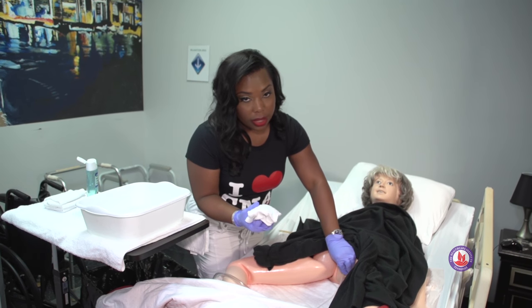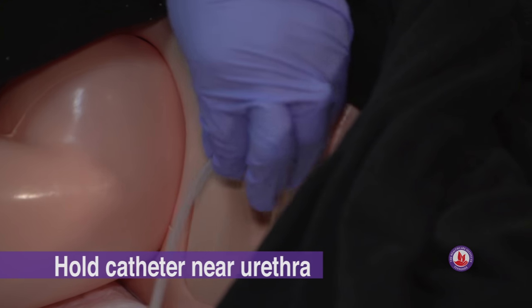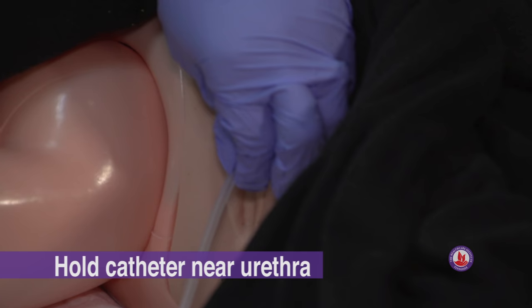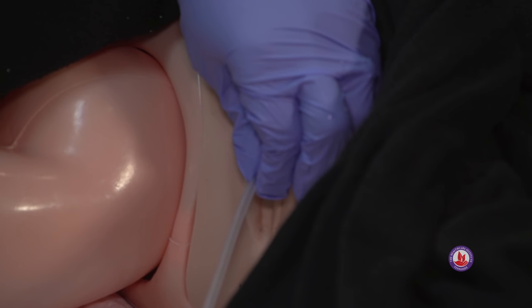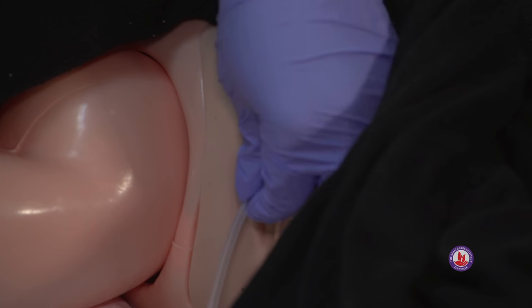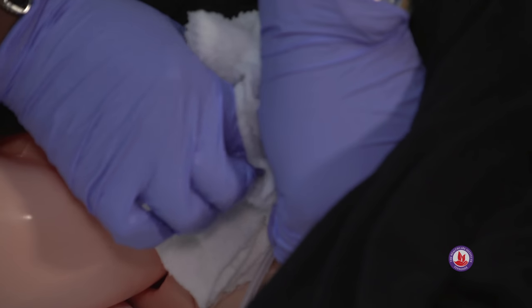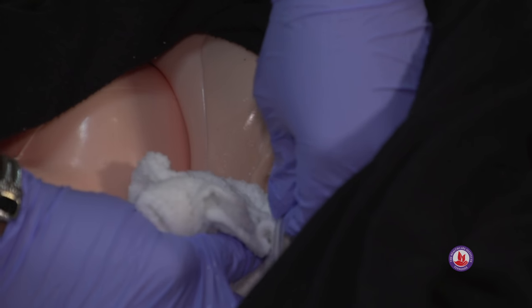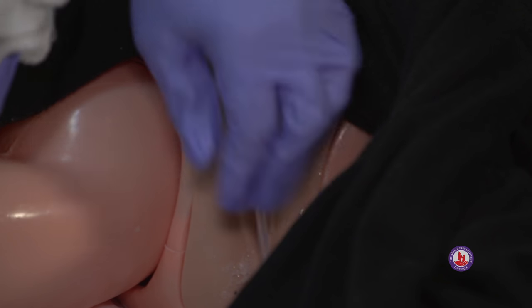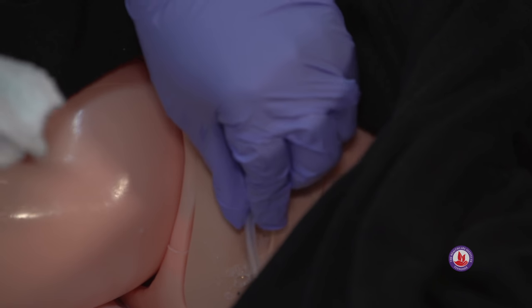We want to hold the catheter at least one inch away from the urethra so that we prevent tugging during this procedure. Remember, we want to clean with a clean stroke every time — one single stroke. The first stroke is going to be around the urethra and down, just like this. At that point, you'll pull one of the leaves back so we're working with a new area of the towel.